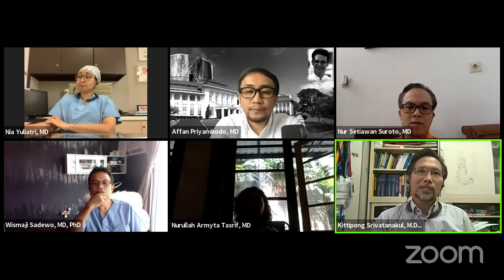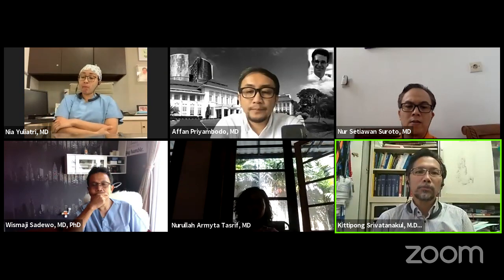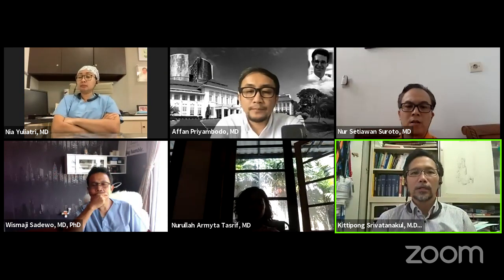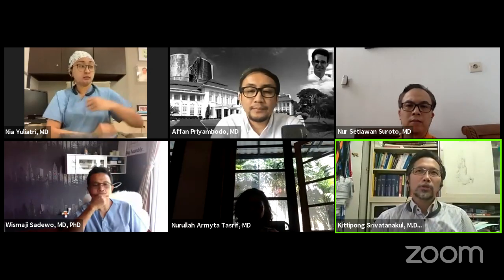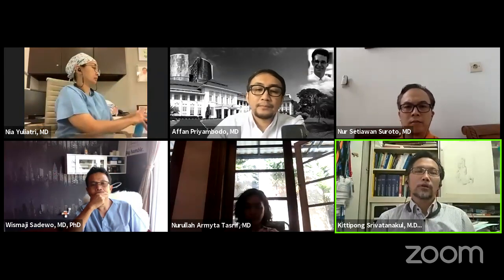But if you want to do preoperative meningioma embolization, you don't have to be perfect. That's not the only treatment for the meningioma. It will be surgically removed. So you only need to reduce the blood supply to help the surgeons operate more easily. So you don't have to be perfect. So particles will be very fine in most of the cases, larger particles.